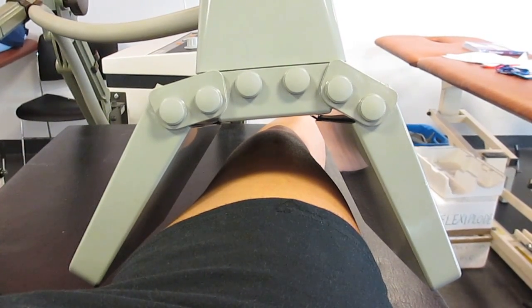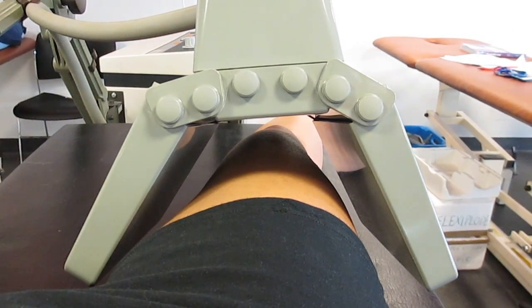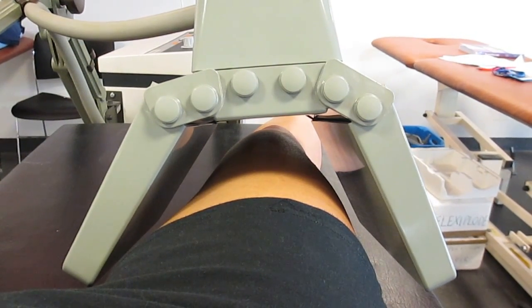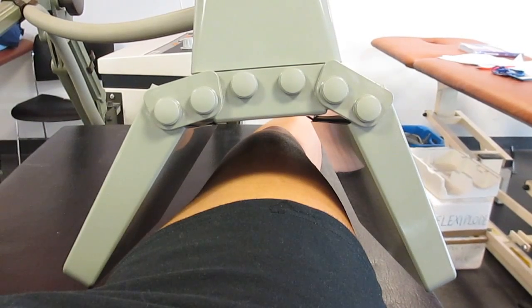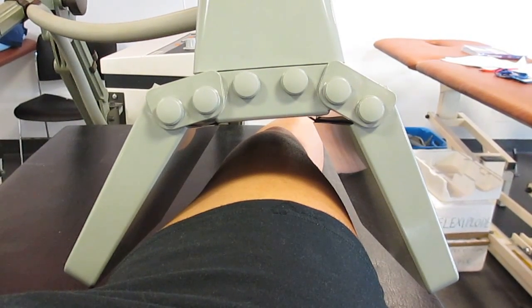Inform the patient what they should expect to feel during the treatment. If you're doing pulsed shortwave therapy they will feel nothing, but if you're doing continuous shortwave therapy they should feel a gentle warmth but not a strong heat or burning.